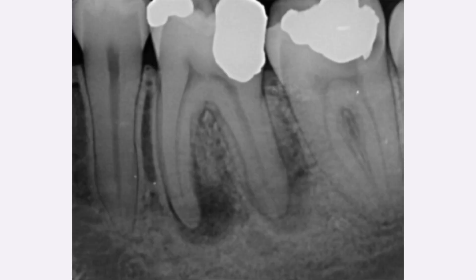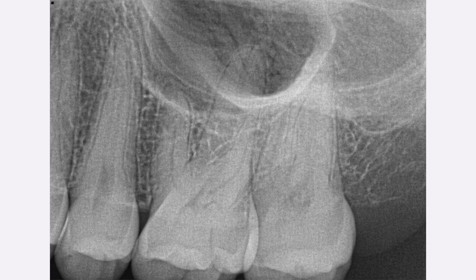Another negative radiolucency can be an infection. Here you can see at the tips of the roots there are black bubbles surrounding them — this is an infection or an abscess, and this tooth will often need a root canal to save it.